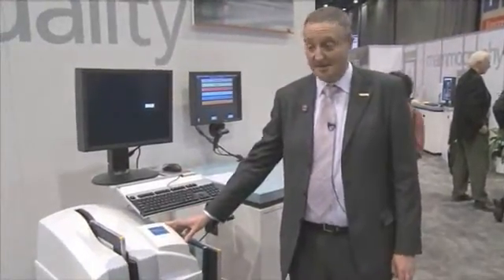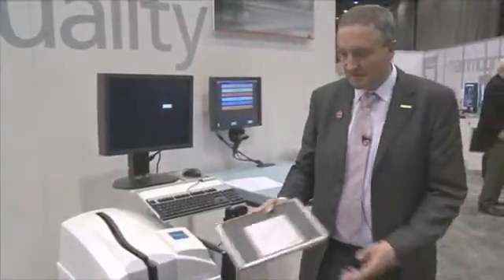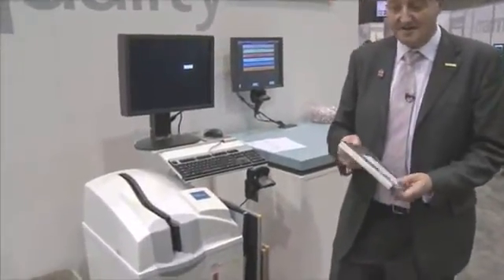This is the latest and greatest CR system from CareStream. It's used for both general and mammography imaging. It's called the CareStream Elite CR system. The benefits of the CareStream CR system for both mammography and general purpose radiography is that we use rigid plates in our cassettes.